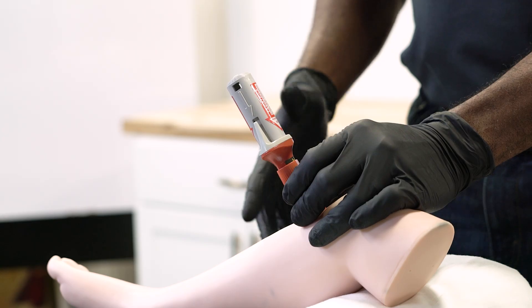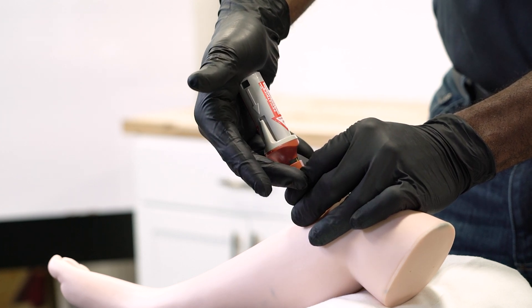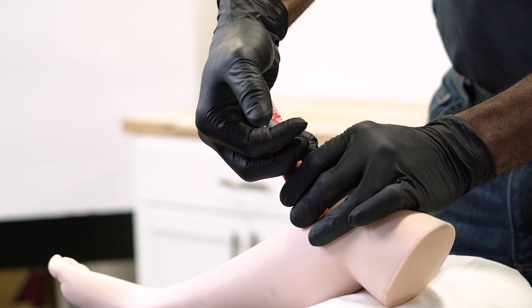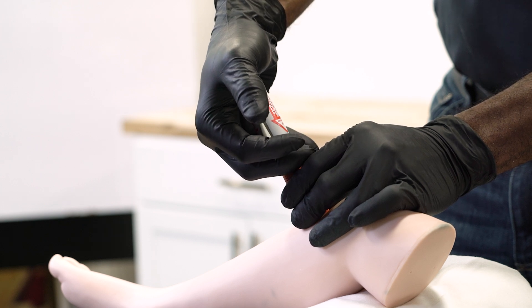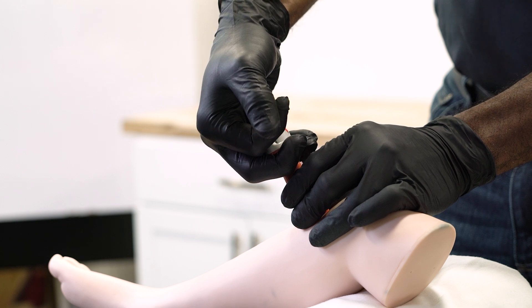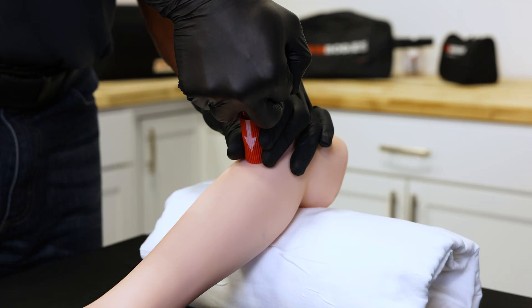Grasp the top of the Big P with your non-stabilizing hand, grabbing the gray trigger wings with your middle and ring fingers until your hand makes a fist. Then apply slight pressure with your palm until the device stops while squeezing the fist you made around the device. This will push your palm down on the gray safety handle while pulling up on the trigger wings to deploy the device.